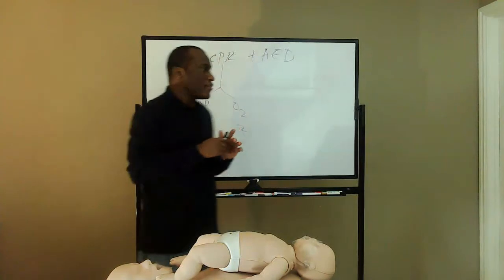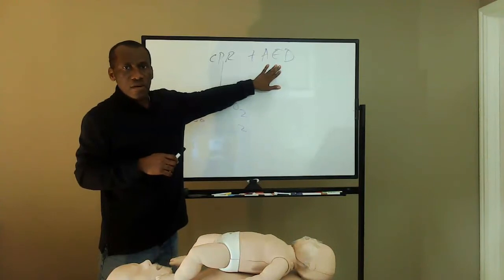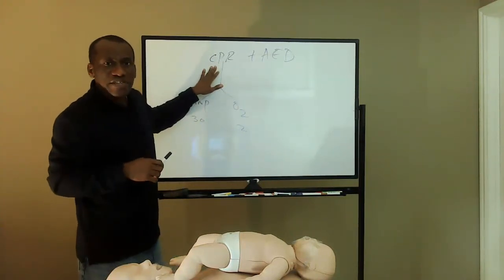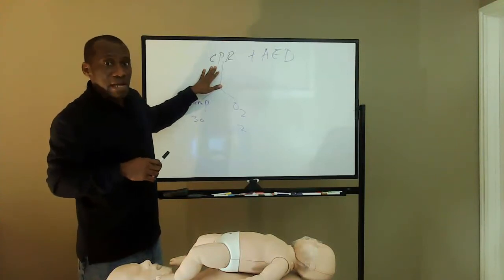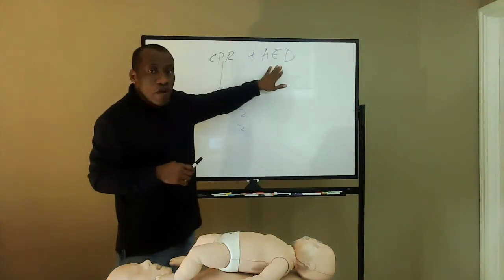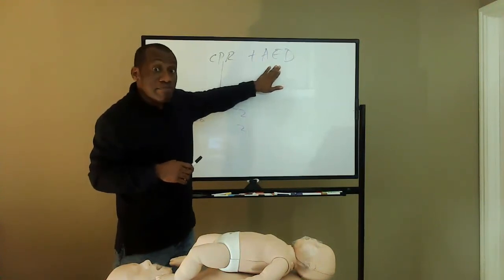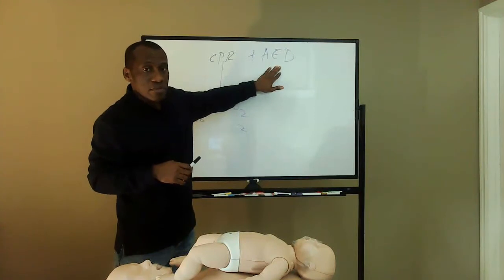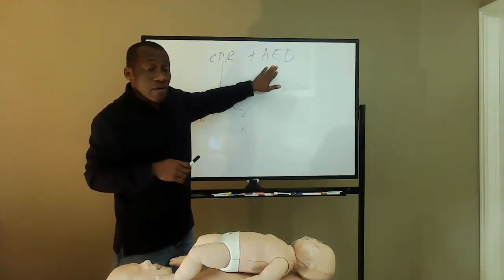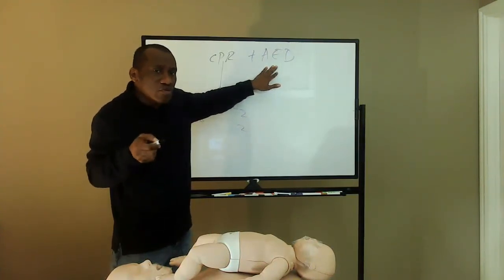So this is what the AED does. Very, very important. With CPR alone, the chance of survival is minimal. But if you bring the AED and combine the two of them, the chance of survival can double or even triple. The chance of survival can increase tremendously by bringing the AED. The reason, of course, is not a surprise, because the AED targets the problem at the root.